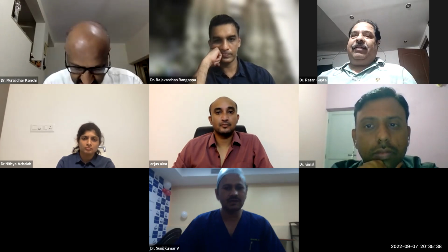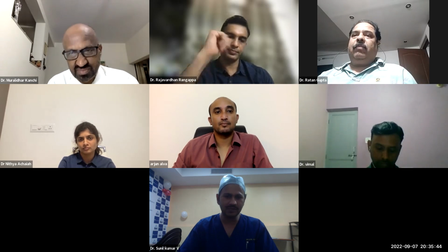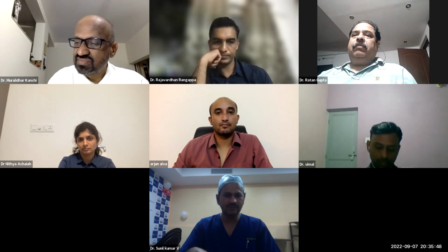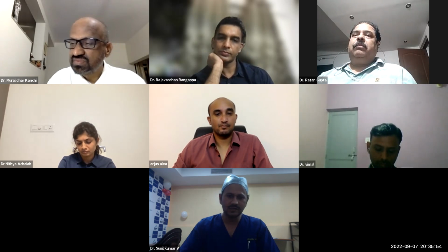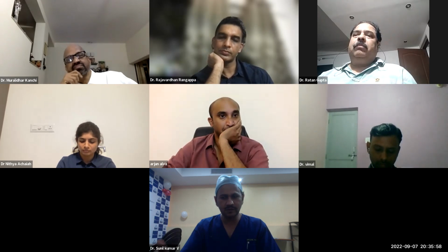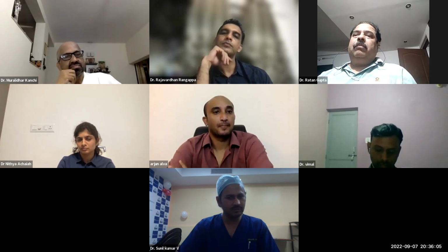Yes, sir. Of course. In VA ECMO, it has a definitive role. As you said, cannula placement, pericardial effusion, any kind of pleural effusion which is causing hypotension or hypoxia. And while weaning also, we'll be checking the LVOT VTI, TAPSE, and E by E prime. All will help.